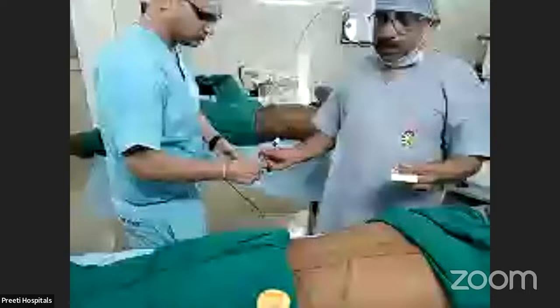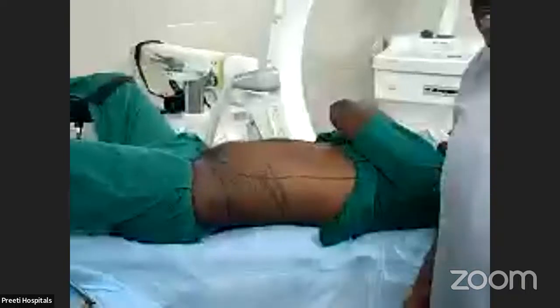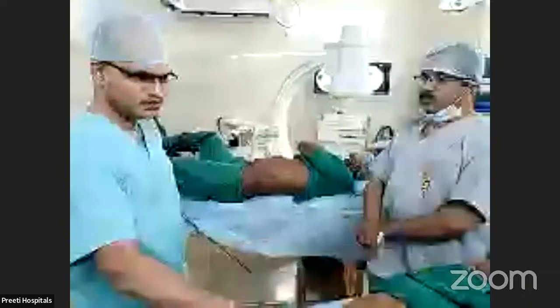If you have a lower pole stone, here also the kidney is like this: your lower pole, your mid pole, your upper pole. Now, you have a lower pole stone here. What will you prefer, prone PCNL or supine PCNL, for a large stone? So for an inferior calyceal large stone, I will prefer prone PCNL.